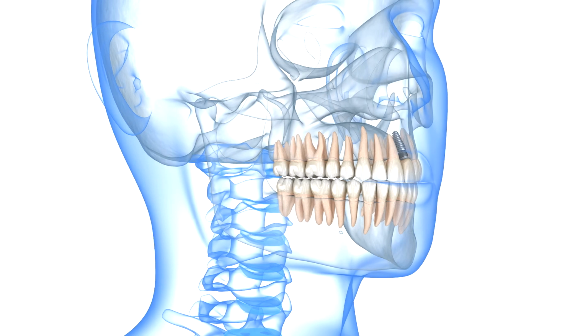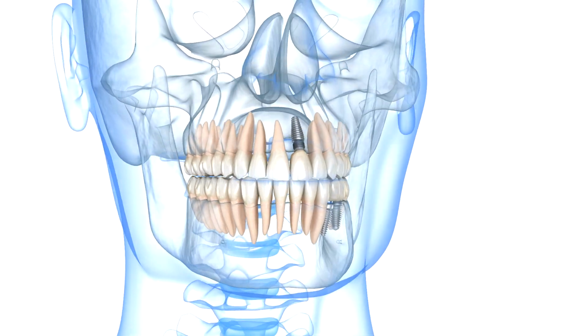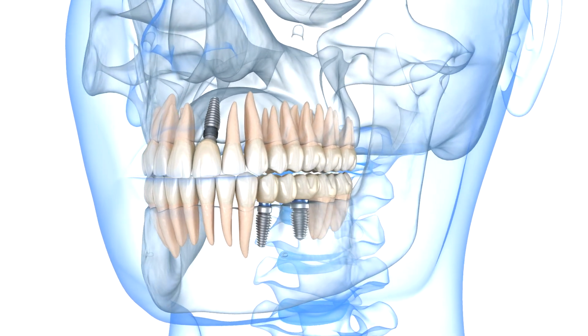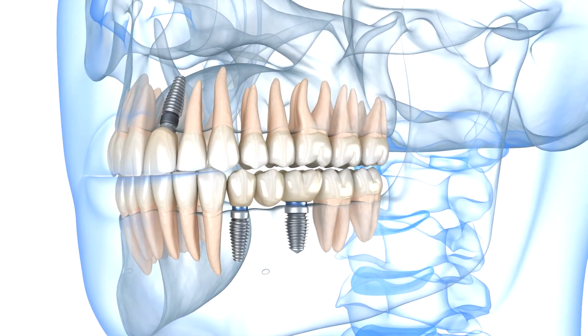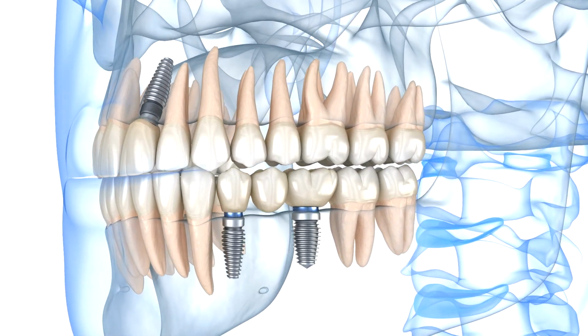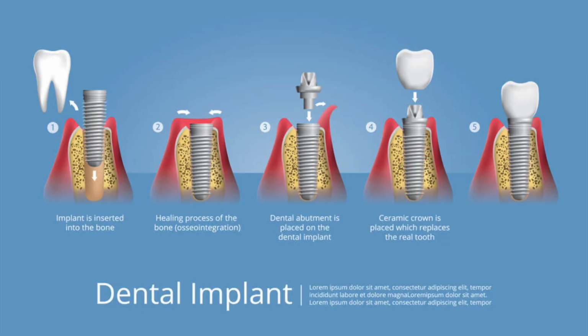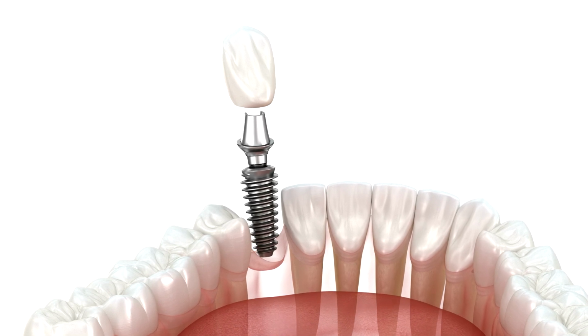4. Implant-abutment connection: the weak link. Now consider the implant-abutment connection. This is the weak link, susceptible to bacterial leakage and micromovement, leading directly to peri-implantitis. Systems use three main types. External hex, the original, simple but the junction is wide and prone to micromovement, leading to screw loosening and crestal bone loss over time.